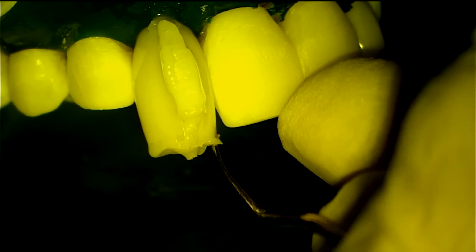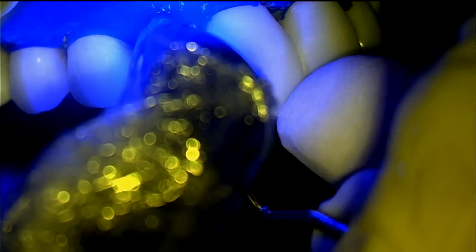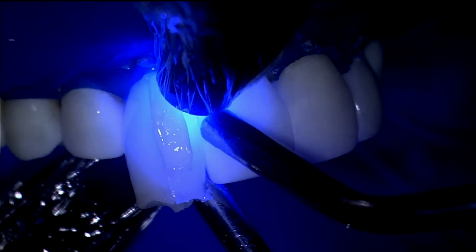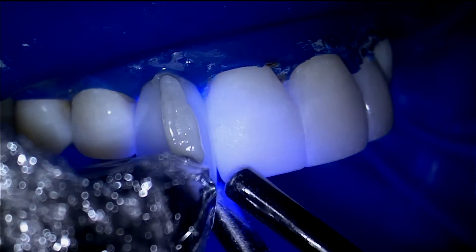Last-minute changes in incisal shape are made right before light curing. Two curing lights can be used to accelerate photopolymerization. Make sure to use air to cool the tooth while you are light curing.